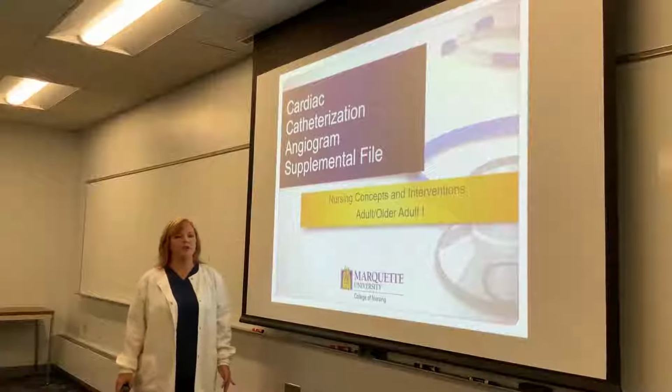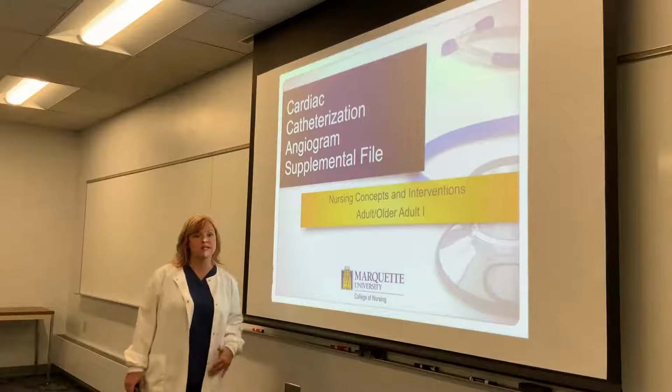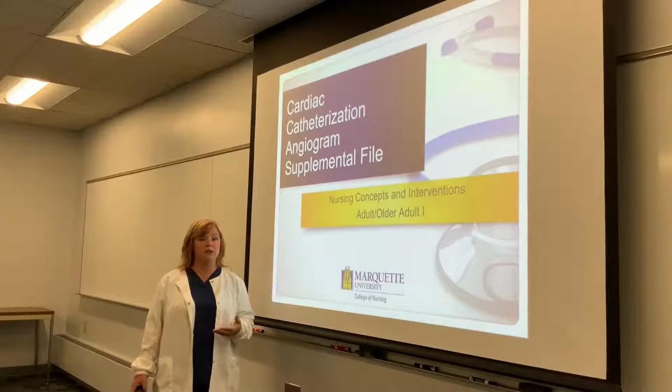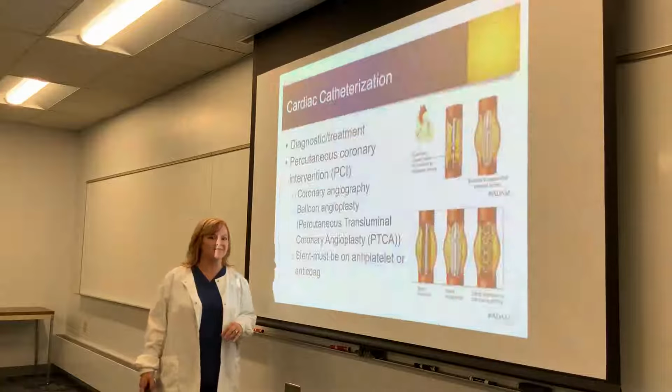This video will have information on cardiac catheterization and cardiac angiogram. The focus will be on the lower extremity site, although note that more and more you're going to see radial and brachial sites being used, but because right now the majority of sites are done through the femoral artery, the video will focus on that.